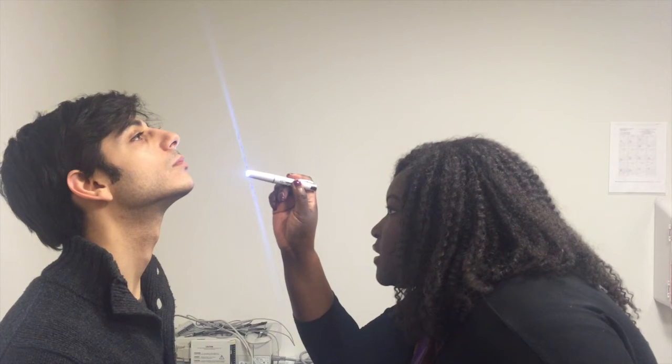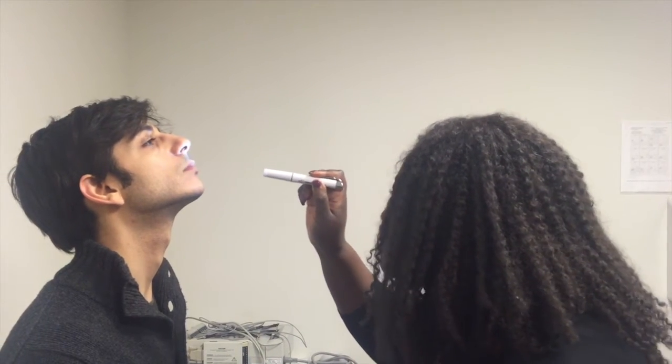Inspect the external nose for symmetry and lesions. Using a light source, inspect the nares. Inquire about any trouble with sense of smell. Perform cranial nerve number 1 testing for those who report trouble. Please refer to your SOP for explanations on how to perform this test. Very good. You can look down again. Any trouble with your sense of smell? No. Okay. So now I'm going to just use this reflex hammer to test some of your reflexes, okay?